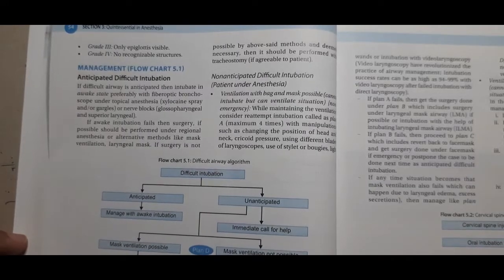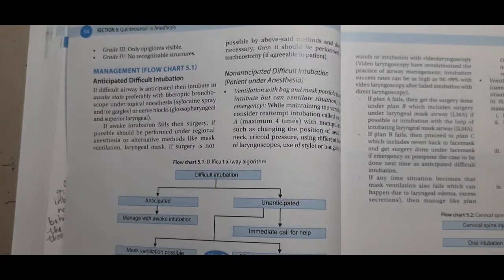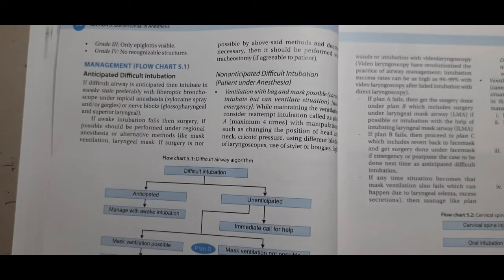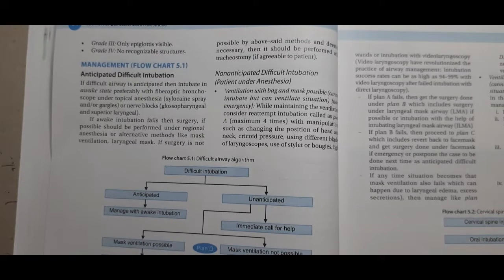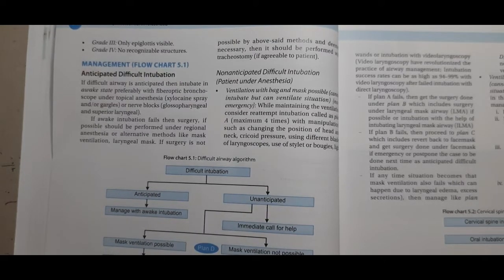So, how do you manage a difficult intubation? You have seen the causes of difficult intubation. You have already seen the assessment of it. Now, how do you manage it? This management is done with the very beautiful flowchart that is given in this textbook. We'll go through the flowchart on how to manage the difficult intubation.